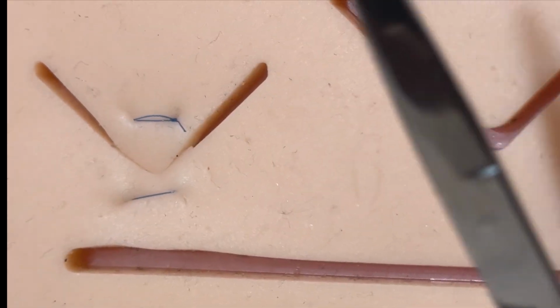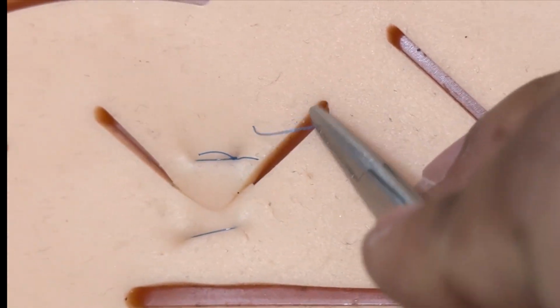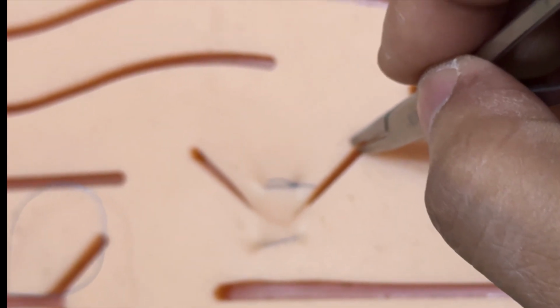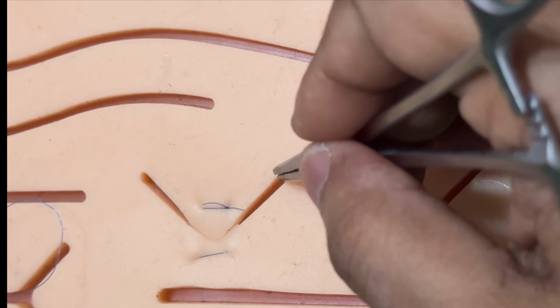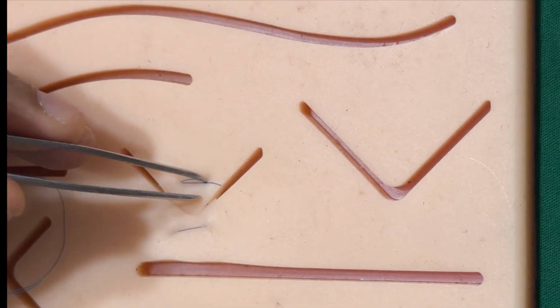This much clear? Now how to remove it? Before removing, let me explain about these areas. Look here, can you see these areas are still not approximated at all, right? So here you have the opportunity to do the suture. With a simple interrupted you can do what is called a horizontal mattress or vertical mattress, depending on the type of wound or thickness of the tissue, etc. Understood my point? Now let me remove this suture and explain.